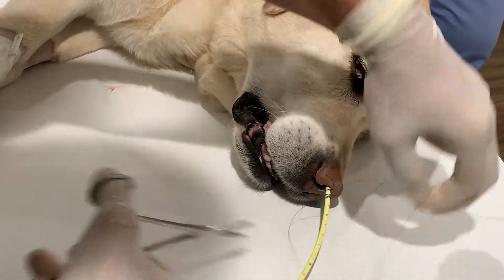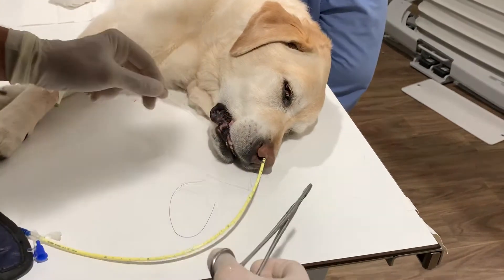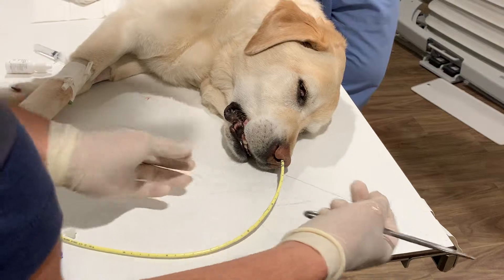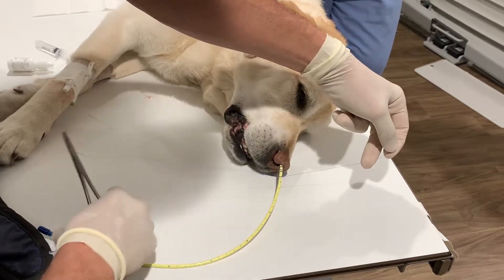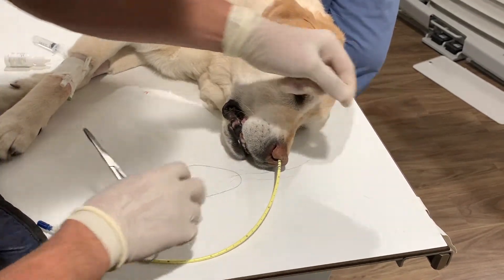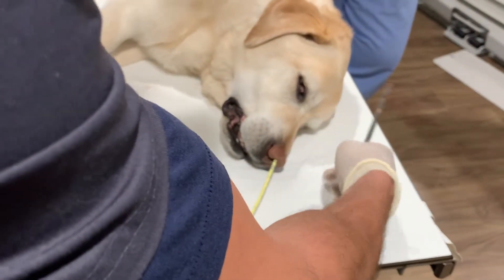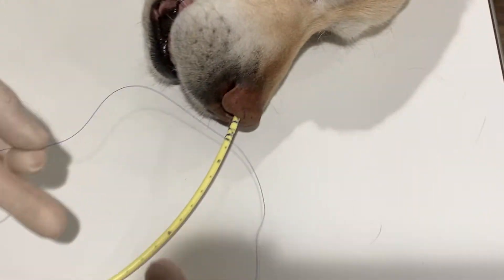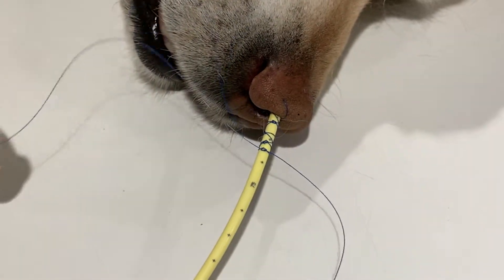Now, if you end up taking a bite with the suture into the nose and you get some bleeding, don't worry too much about it — just some gentle pressure and that'll help stop the bleeding. There's no rule on how long you want to make the Chinese finger trap, but I would say the more you can do the better. So when you take your original bites into the nose, you want to make sure you have enough suture material on both sides to do the Chinese finger trap.